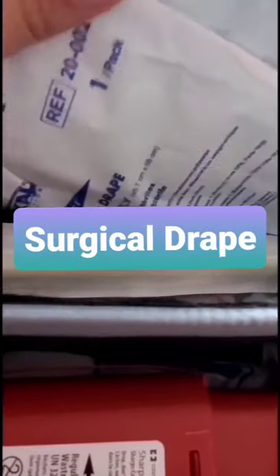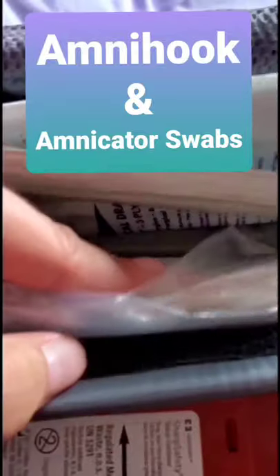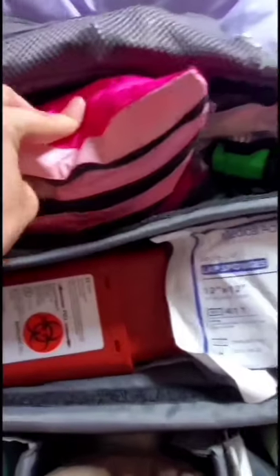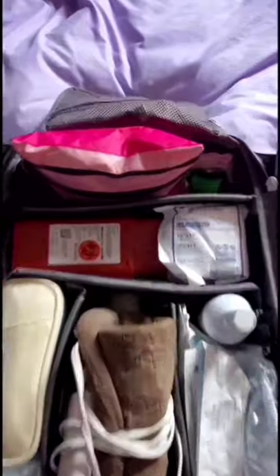Along with my suture, needle and syringe bag and headlamp, I also keep my sterile drapes to set up a good sterile field — surgical drapes are in there. Just underneath I keep my amnio hook and amniotic fluid indicators. I don't find I use either of those much at home, but they're there if I need them.